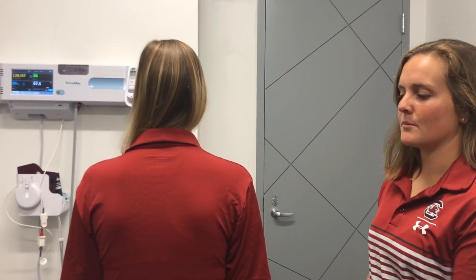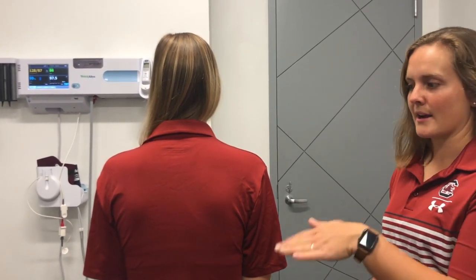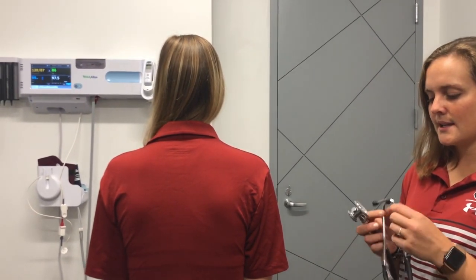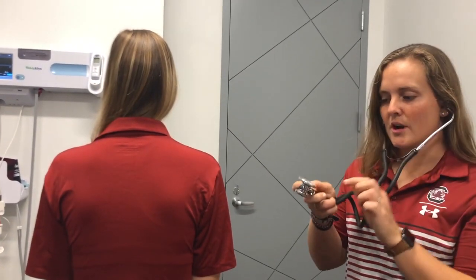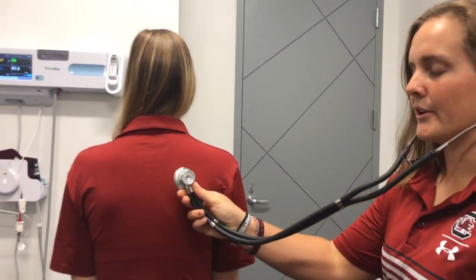You will stand next to the patient and with having their back exposed — for the purpose of this video I'll keep the back covered — then you will put in the stethoscope with the tips pointing forward and make sure the drum, the big part of the drum, is going directly on the back.